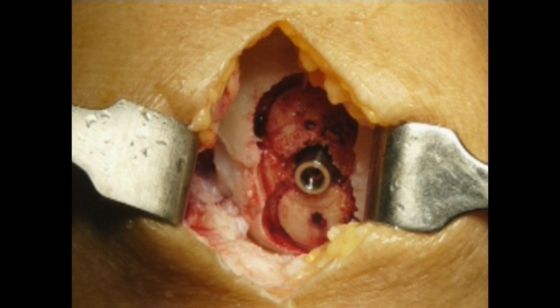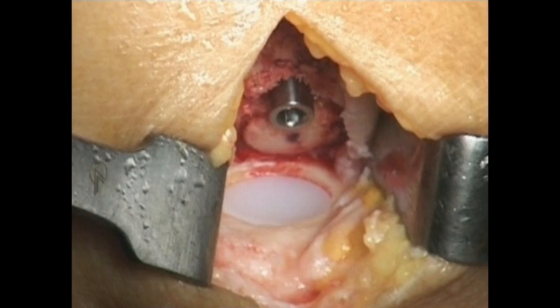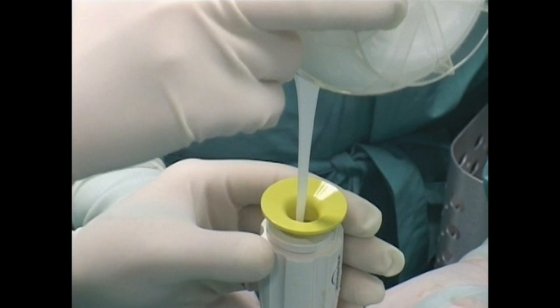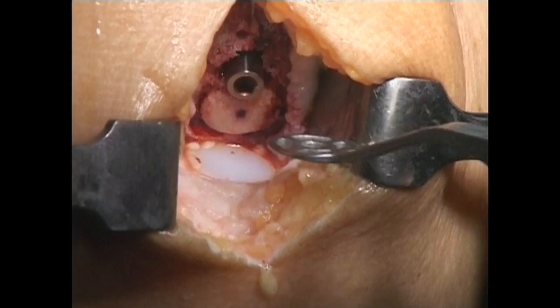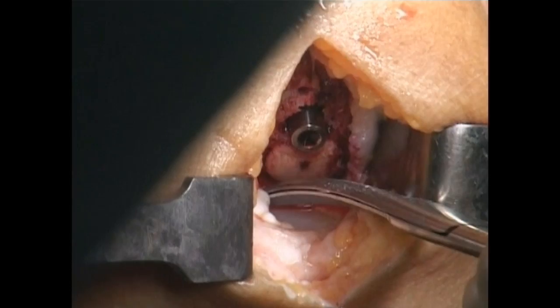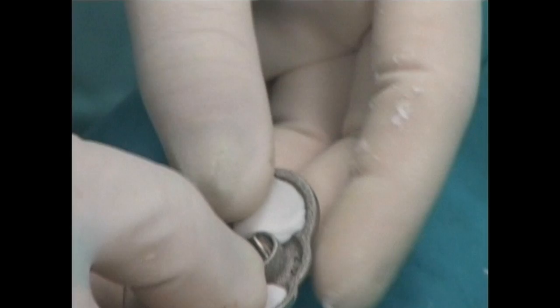The taper post is inserted into the sizing trial handle and advanced into the bone with a hex driver. The prepared femur site and the tibial component in situ are evaluated. The final tibial implant is cemented before the final femur component is implanted. The cement injector is advanced through the distal tibial tunnel. The tibial implant bed and tunnel are cemented under pressure. The tibial template is used to apply downward pressure onto the tibial component to seat it in its final position. Finally, pea-sized balls of cement are applied to the underside of the femur component, which is then applied using a specific impactor.